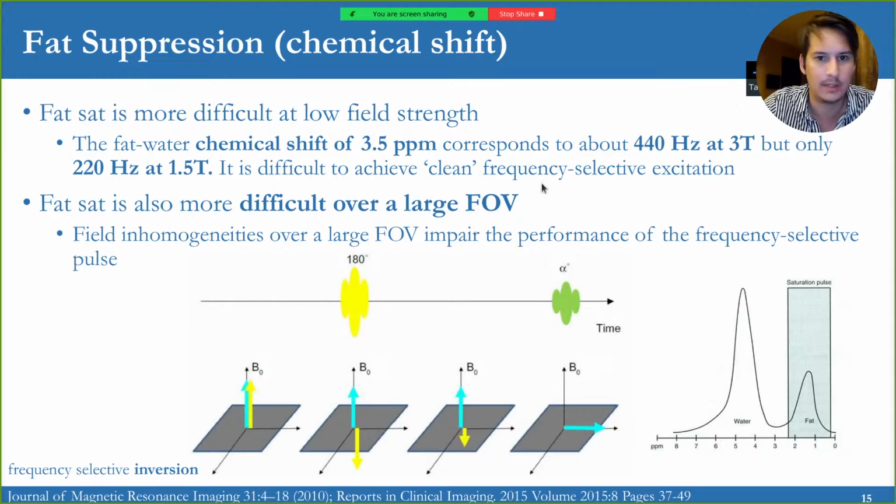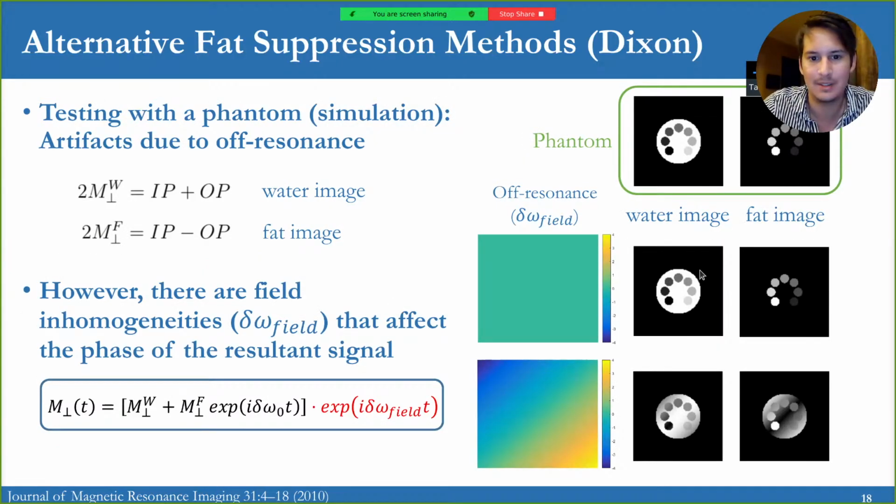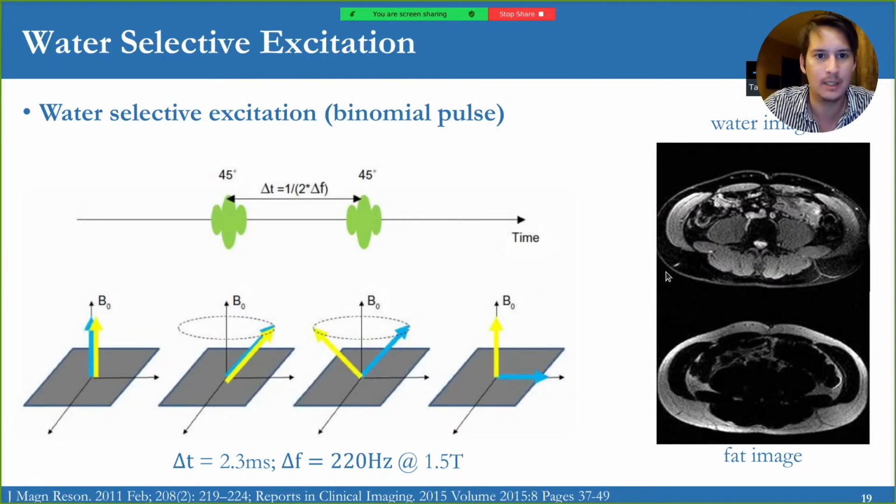You can check these slides out afterwards if you want to know more, because it's a little bit complicated. And obviously you can do a selective excitation, so you're not exciting the fat at any moment.